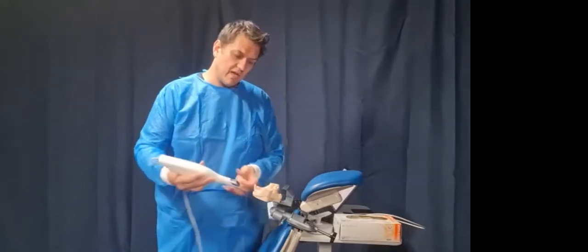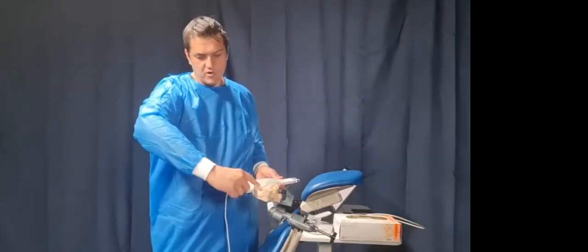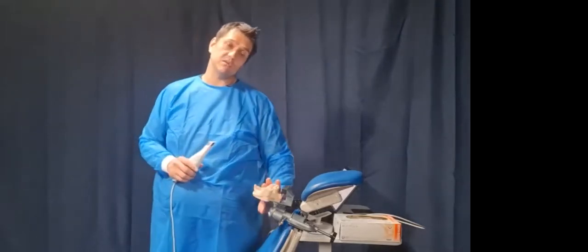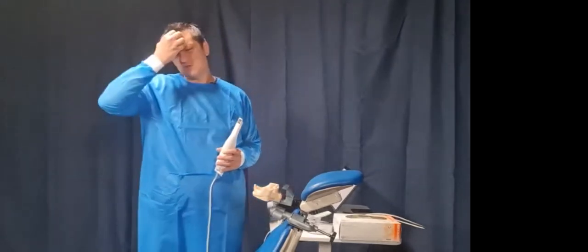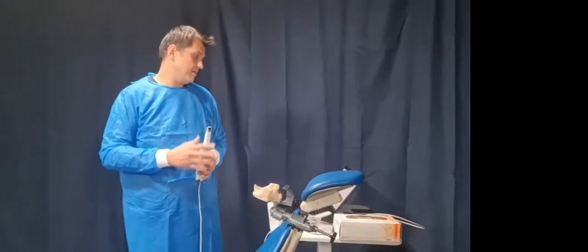And then basically I came around the other side and worked my way back. And again, I rolled over the ridge just like I'd roll over an incisal edge, and again, retracted the cheek on this side. So that's how I actually recorded that, and I got a really good record of this patient. The outcome was an acrylic denture, and I was very surprised that the outcome was as good as it was. It was a very, very good case and good patient.